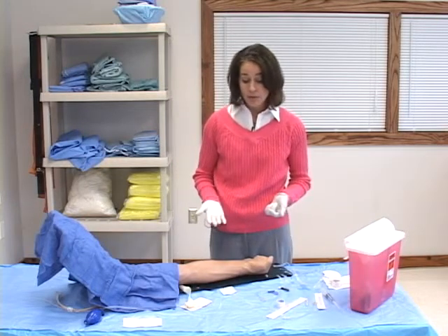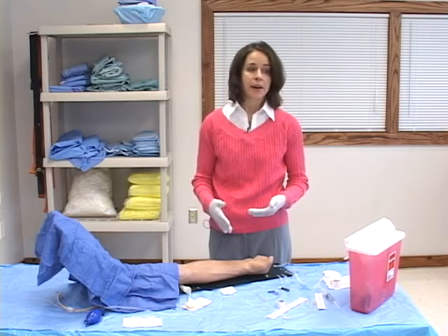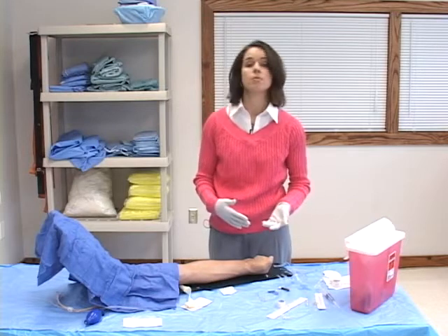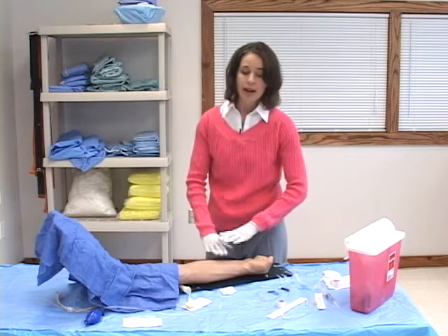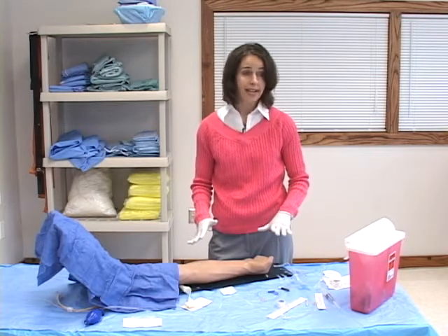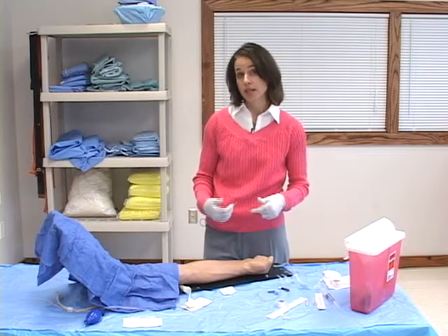An important thing to remember for children is that children experience pain just like adults do, and you want to be sure to provide an appropriate anesthetic. So something that I like to use would be a topical anesthetic cream, and you would apply this once you assess the child and determine which site looked good for access. You would go ahead and apply the topical anesthetic and let it sit for a few minutes to get appropriate numbing.